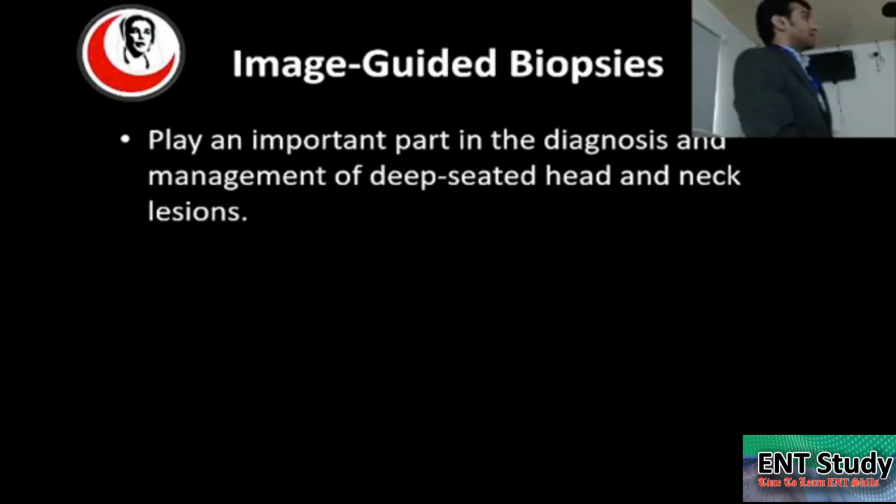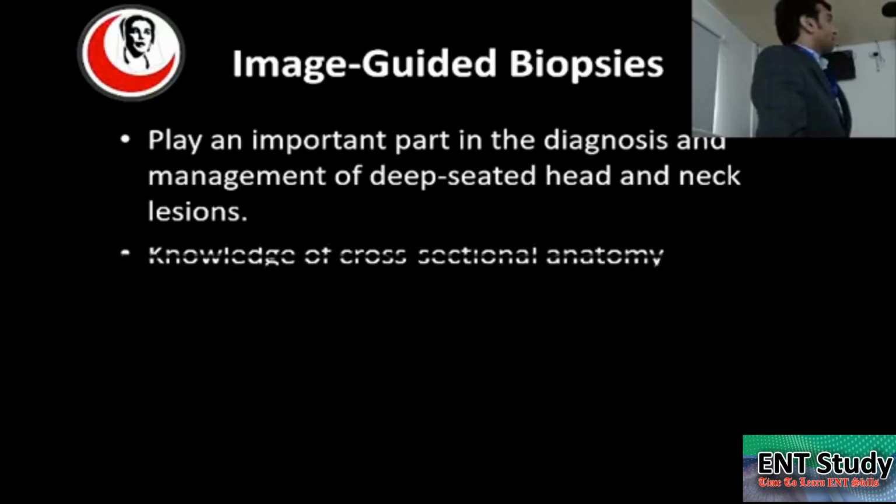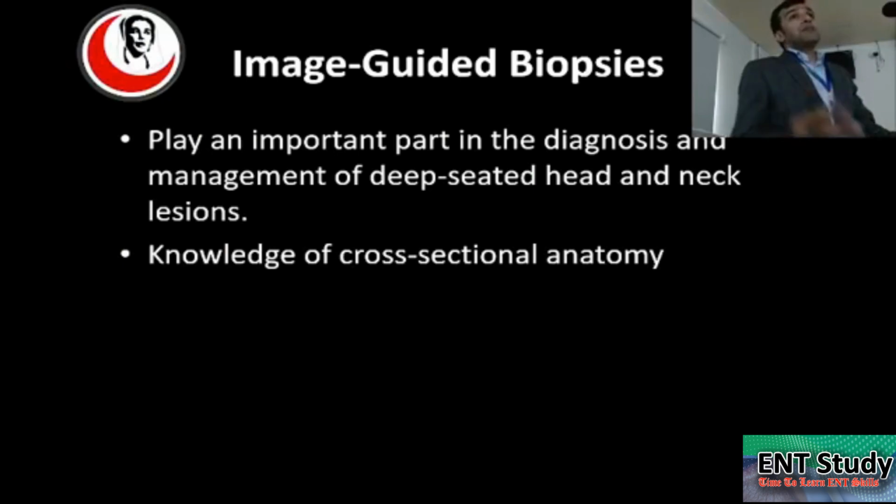Now, image-guided biopsy plays an important part in the diagnosis and management of deep-seated head and neck lesions. For superficial and palpable lesions, biopsies can be done by the ENT surgeons or the maxillofacial surgeons. But in the case of deep-seated head and neck lesions, image-guided, that is CT-guided, biopsy is important. With knowledge of cross-sectional anatomy, we can see the anatomical structures in the path of the needle, so it is very important to know the cross-sectional anatomy.